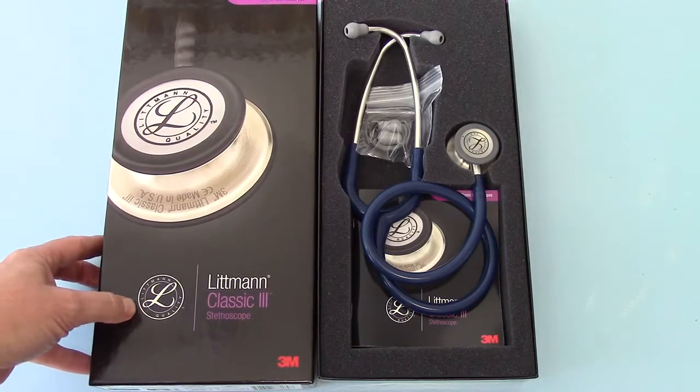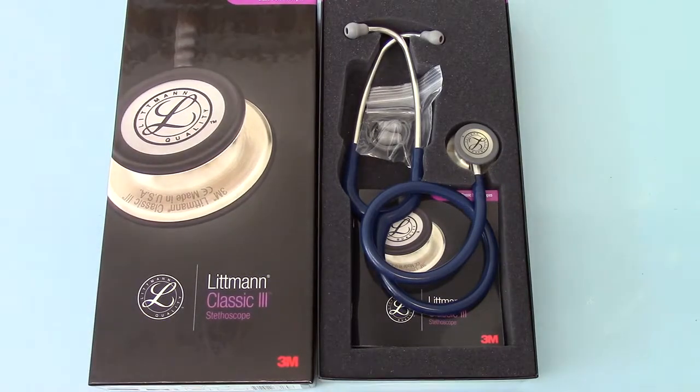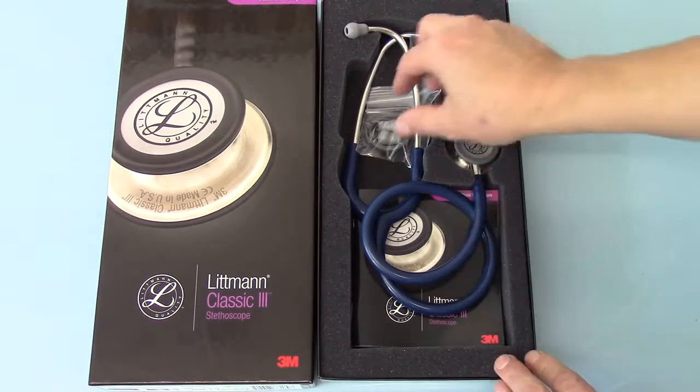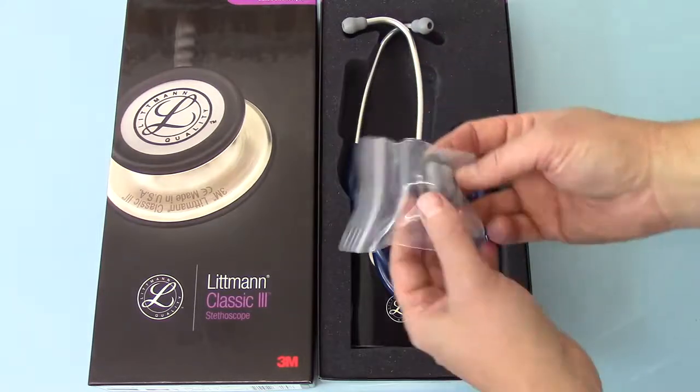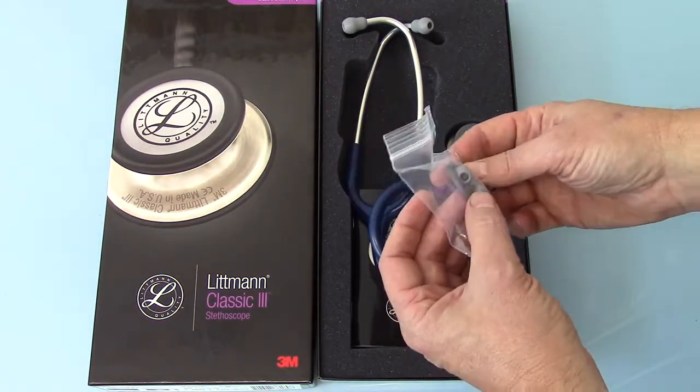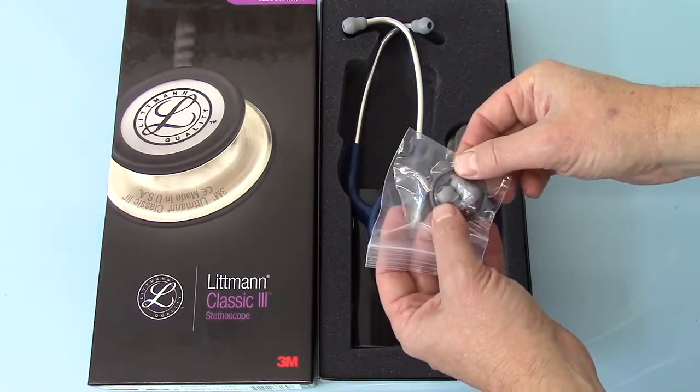The pack outer shows the new design head. Moving over to show you the actual stethoscope you get — this is the pack contents as it comes from the manufacturer. You get a spare set of soft, medium, and small ear tips, and you also get a ring.